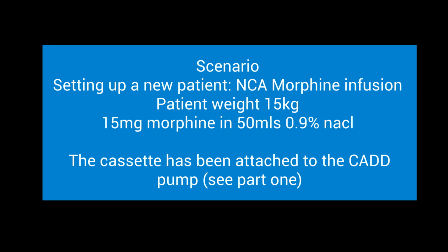The patient weight is 15 kilograms. They have been prescribed 15 milligrams of morphine in 50 mils of saline. The infusion has been made up and the cassette has been attached to the CADD pump.